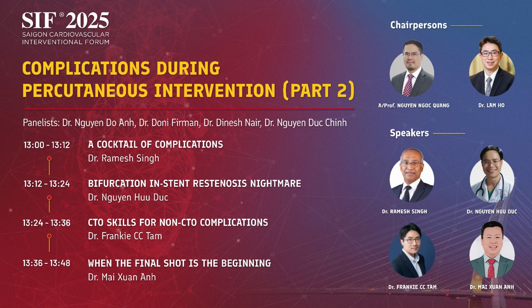But if it is not very calcified, only a fibrotic lesion, I will do what Professor Quang asked. I try balloon first. If it improves the FFR, maybe I will use DCB because the patient is very old. So I think in the long term, DCB may be enough. Thank you.